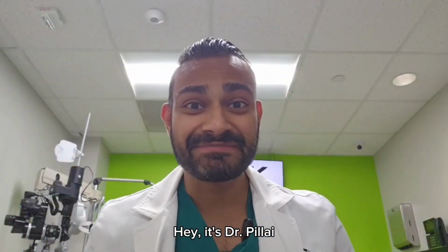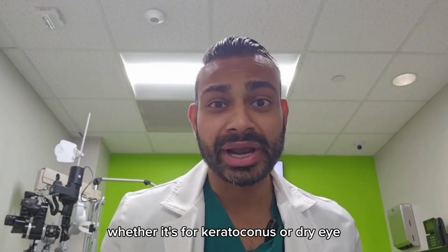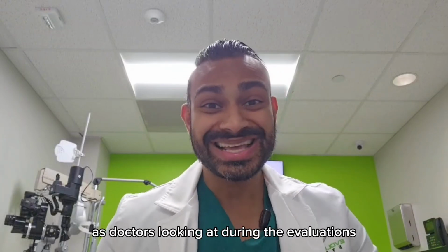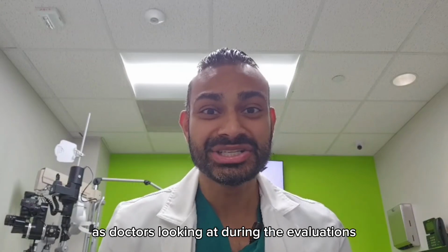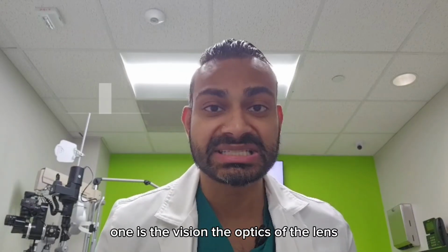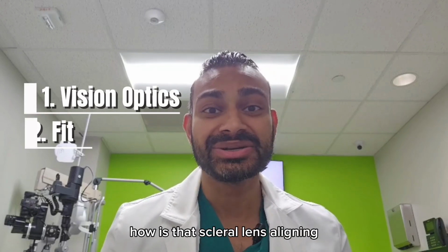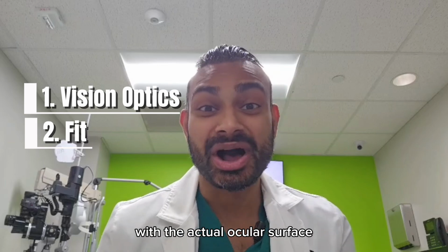Hey, it's Dr. Pillai. Now, many patients that wear scleral lenses, whether it's for keratoconus or dry eye, may be wondering what are we as doctors looking at during the evaluations? Well, there's two important things we're looking at. One is the vision, the optics of the lens, and the second is going to be the actual fit. How is that scleral lens aligning with the actual ocular surface?